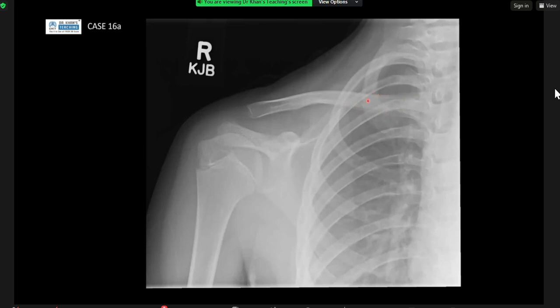Because like what Dr. Kapoor said earlier, when you have more aggressive periosteal reaction, the bone has not had time to lay down, so you get partial laying down of bone, and then with destruction, you get Codman's triangle. Can you imagine that the periosteum is trying to lay down, but part of it is just not, because it's being eaten away by whatever destructive process it is. So there's smooth periosteal reaction, bony expansion.